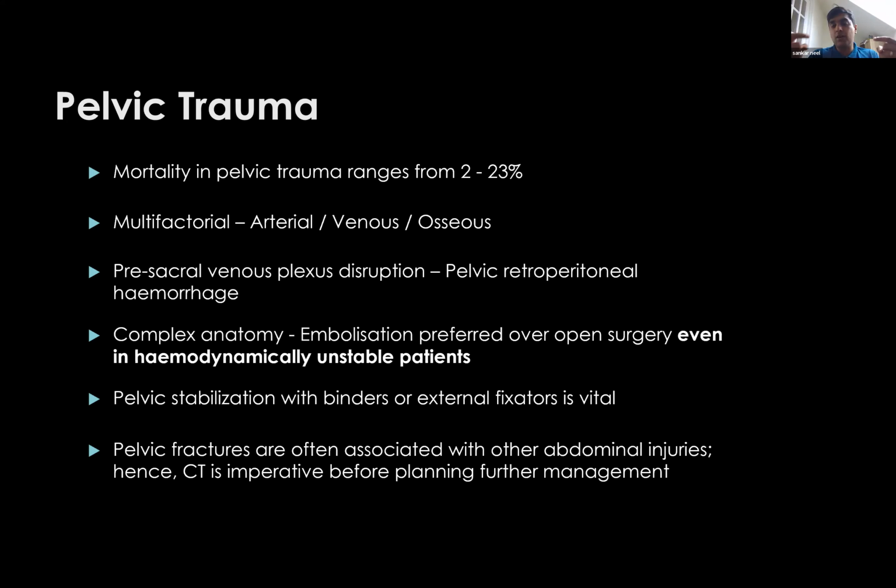For us, we basically get punctures and vessels fairly easily, and we've only got the internal iliac to target. So for us, it's relatively simpler to reach than surgeons. So therefore, you need to fix the entire pelvis in place just before we get in, after we cannulate the artery, and then remove the binder and then do a gram. You will be able to demonstrate the bleed, and then you take it out with some sort of management.